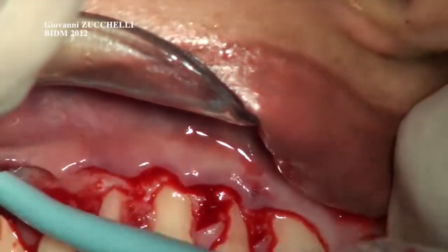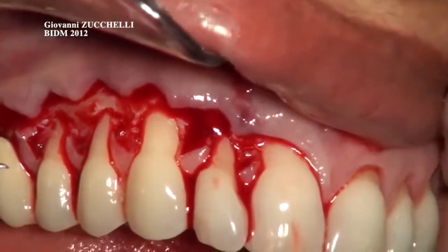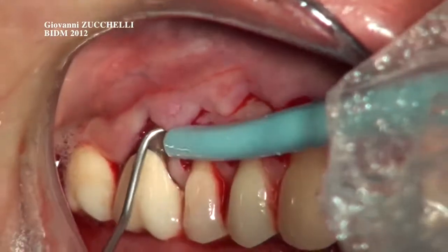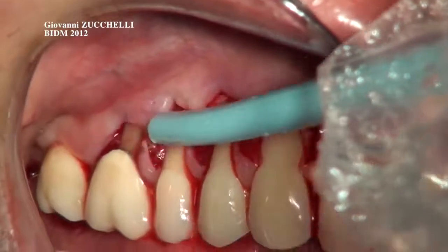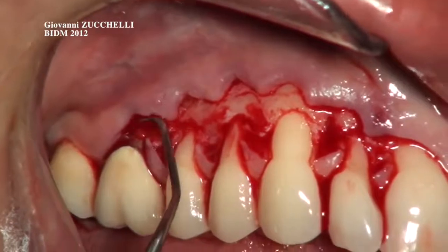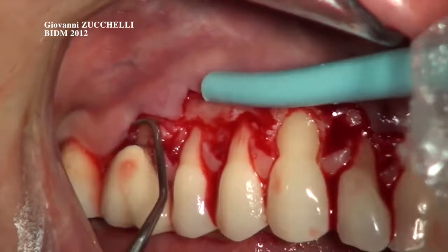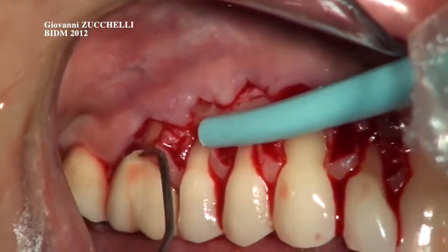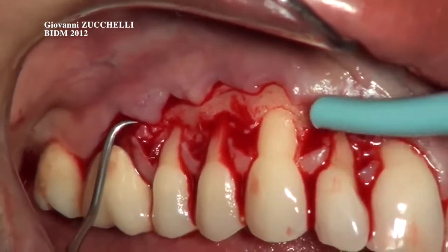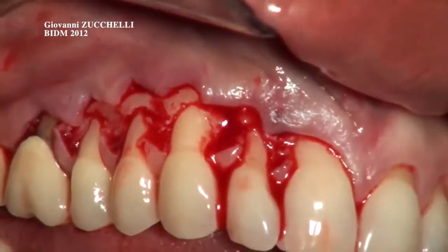Please suction here. Okay. Suction here. Stay here. It's the sound of the root that tells you when the root is ready to finish the root planing procedure. Okay, now the flap is ready.